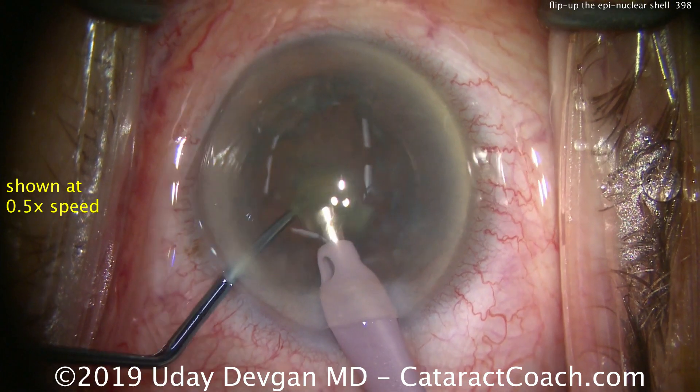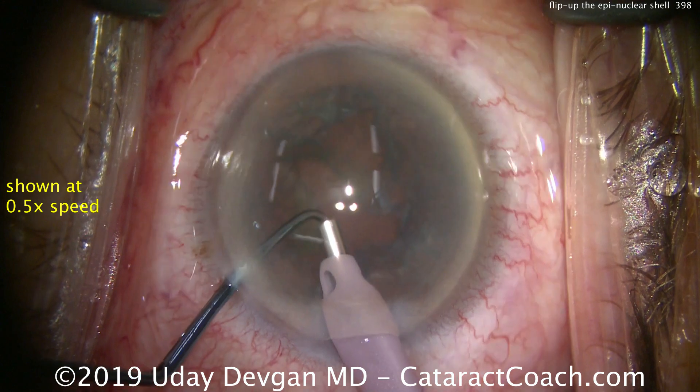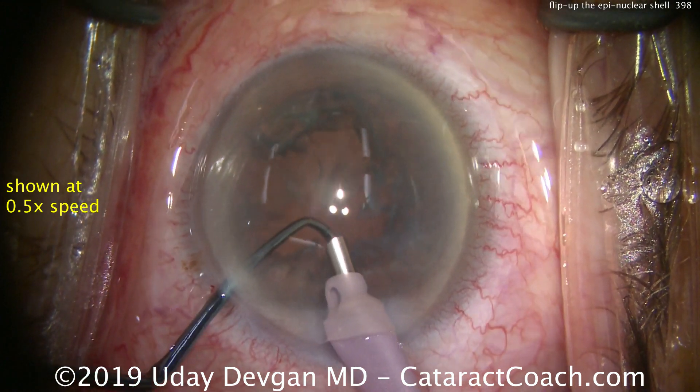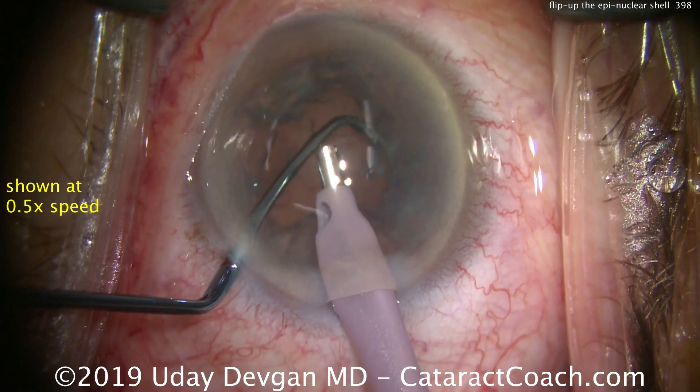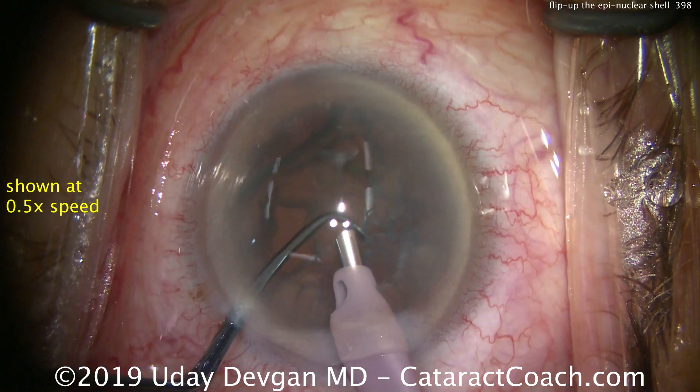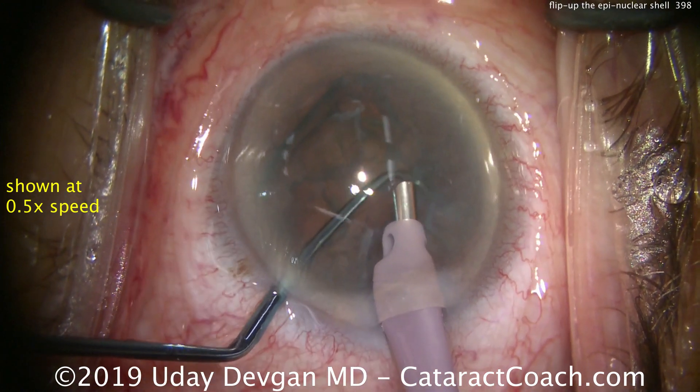Grab onto a piece of it, bring it centrally, and then flip it up with the chopper. There's the last nuclear piece. Here comes the epinucleus in slow motion — chopper there to prevent the capsular bag from coming up. Low vacuum to grab it; didn't quite work, we'll try again in a different spot.